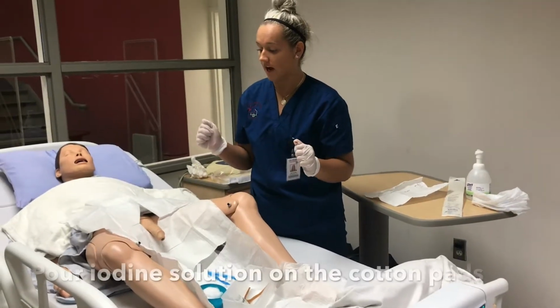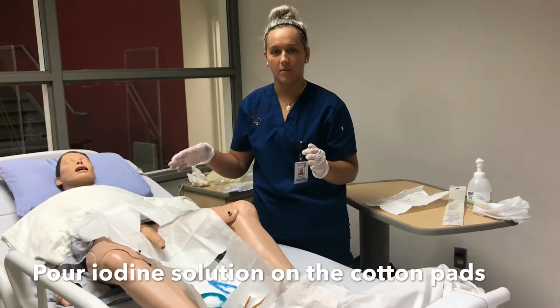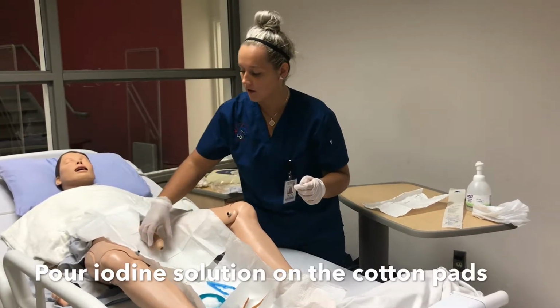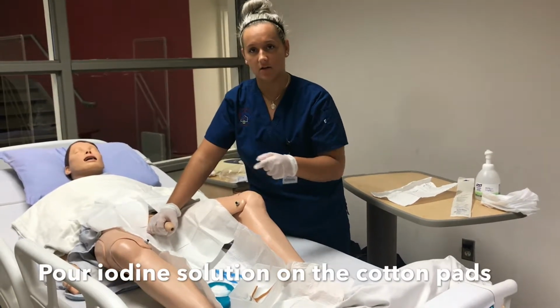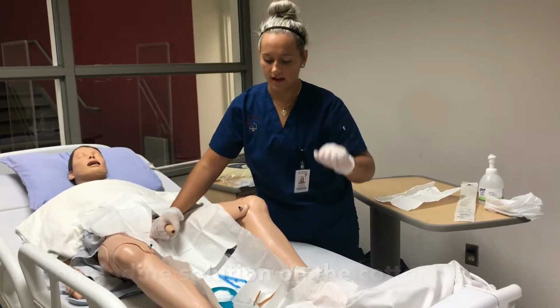Okay, so now I'm going to grab the shaft of the penis with my non-dominant hand. So once I grab the shaft of the penis, I know that this hand is no longer sterile, and so this is my only sterile hand.